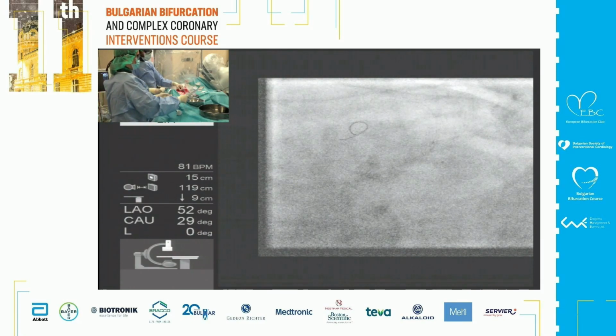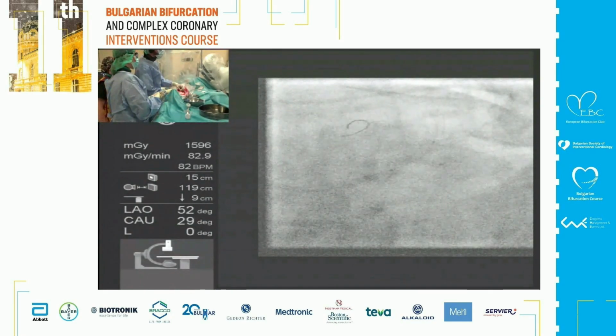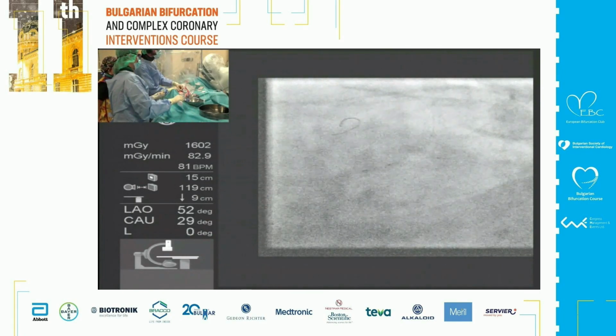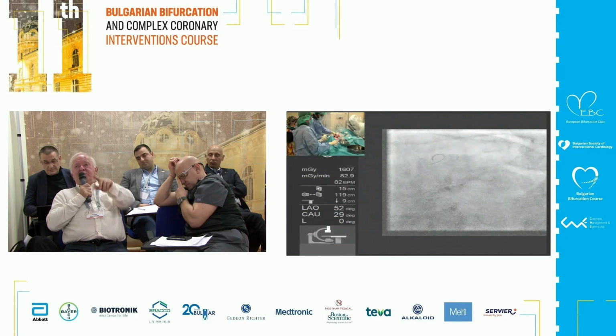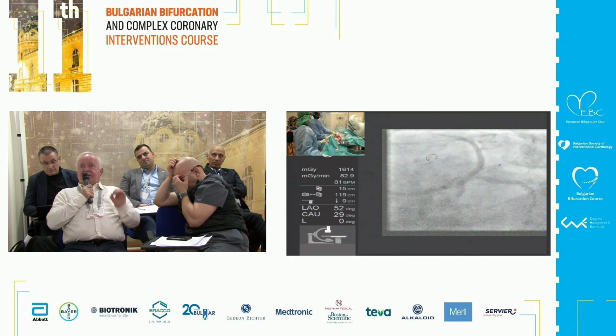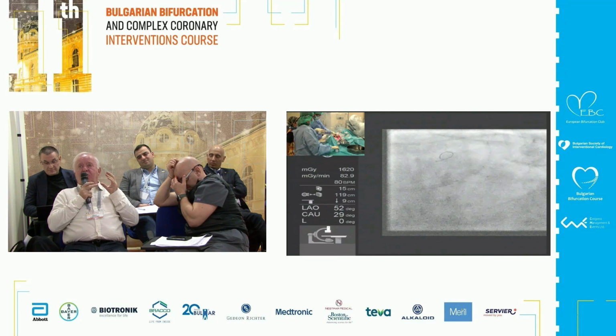I have a question to you. When you do this kind of kissing, you are essentially targeting a specific space of this dilatation. Essentially, this one might not require a final POT, as you said. Which one of the balloons are you putting more proximal? The bigger, always. Of course, it can be the contrary, it doesn't matter. The problem is not to add the two diameters all along the left main.